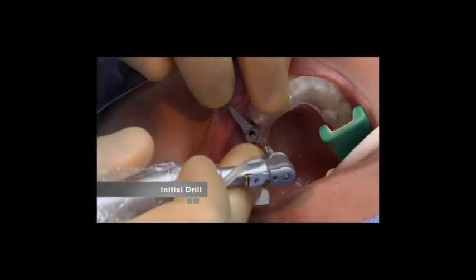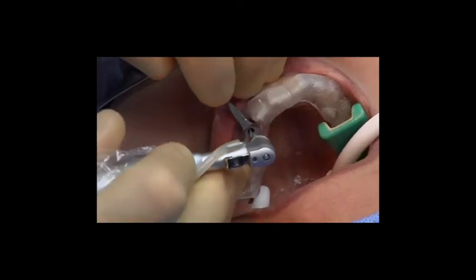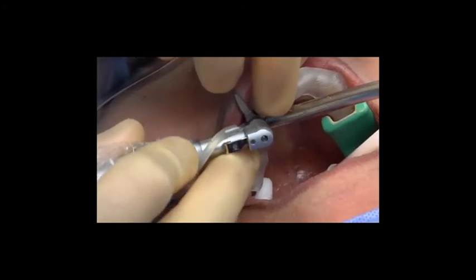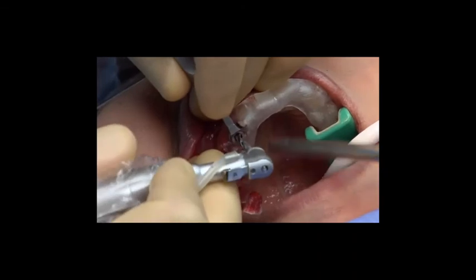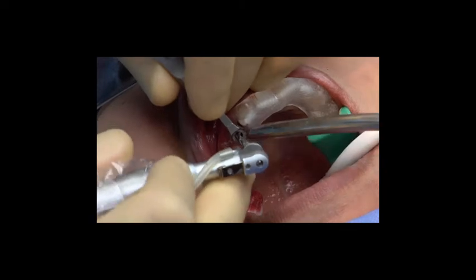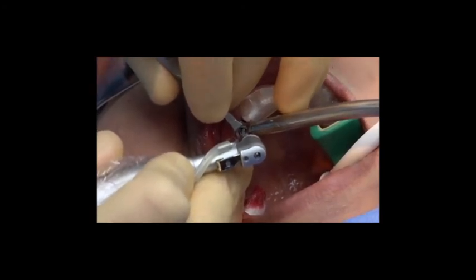Some of them are keyless, some of them are with keys. However, keys are not a problem in the anterior area. You can see here that we have placed a bite block on the right side and on the left side to stabilize the guide, and then the keys get stabilized, and then the drilling sequence commences here with the sequential drilling with the Straumann guided surgery system. So we first, without flap reflection, go ahead and prepare our osteotomy through this OptiGuide.